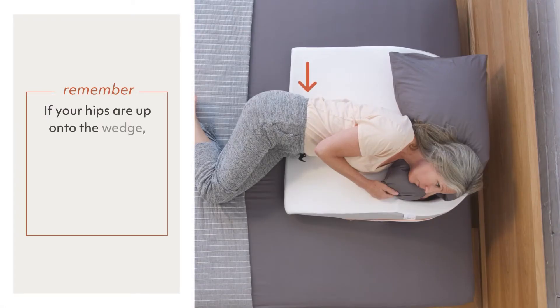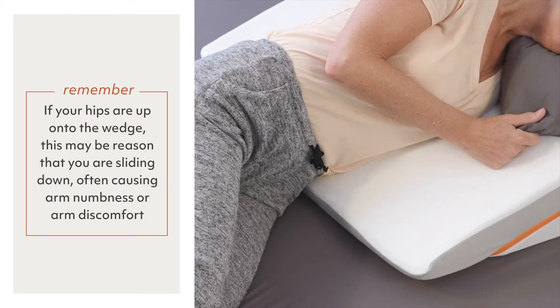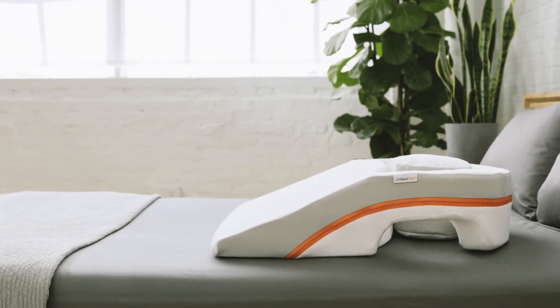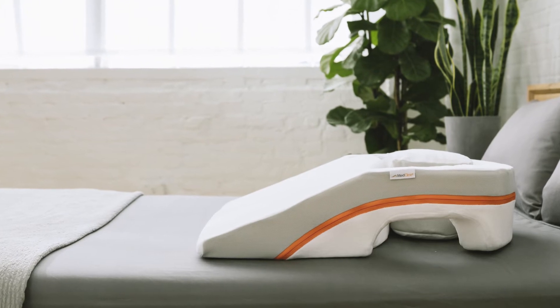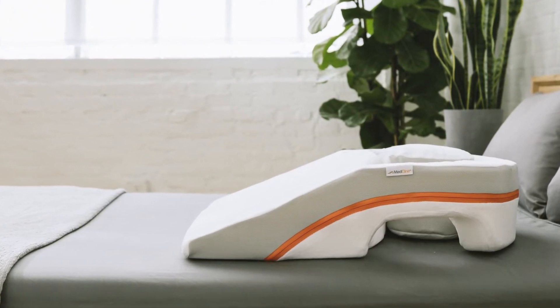If your hips are up onto the wedge, this may be the reason that you are sliding down, often causing arm numbness or arm discomfort, as your hips naturally want to find the bed surface during the night. If this is the case for you, please give us a call so that we can send you a wedge that will better fit your torso. We offer free size exchanges so you have the best MedCline product to help you sleep better.